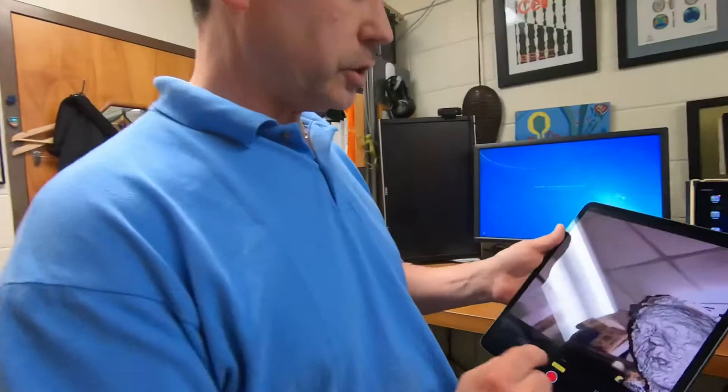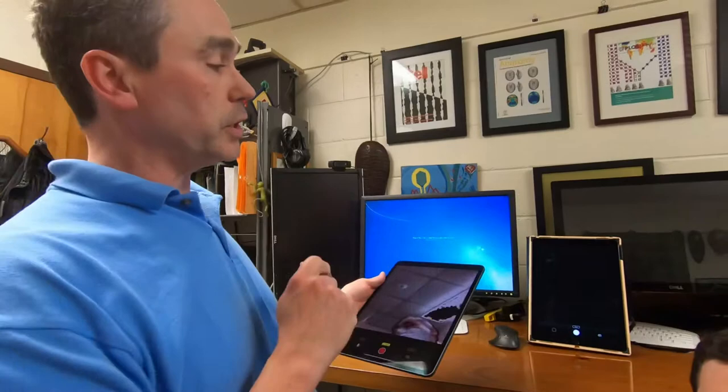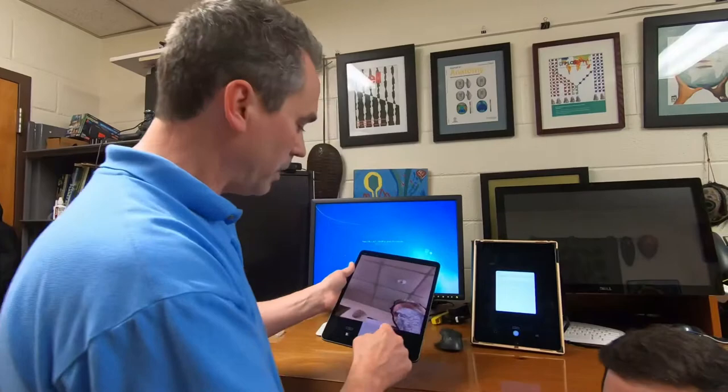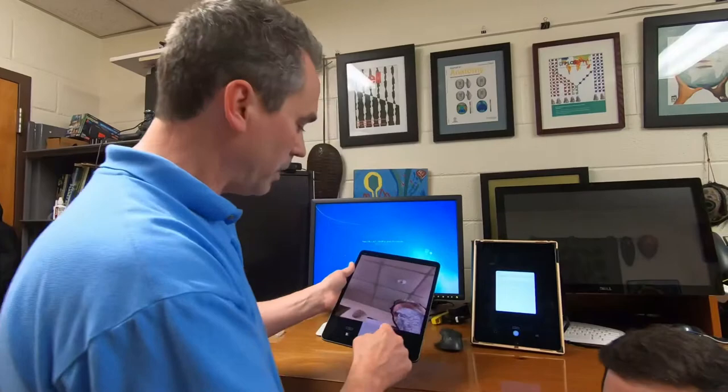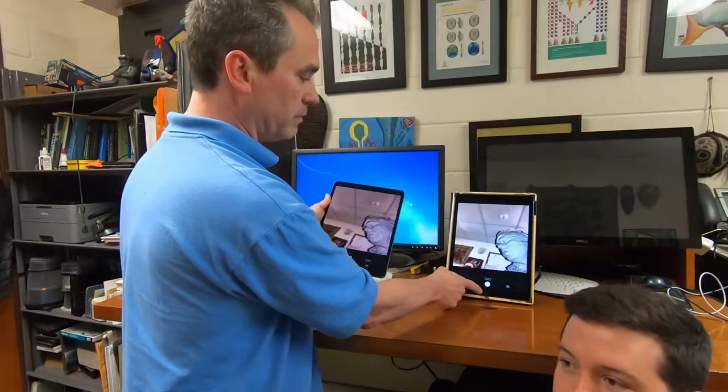So you first open the app. Ideally you have two iPads so that you can have one as a monitor. The app links up automatically between the devices as long as they're both on Wi-Fi. You just double tap the main screen, start sharing, it asks you which iPad, you say accept — you're just linking the two together — and then you say done. And then this second iPad is a monitor now, so we can see what we're doing.